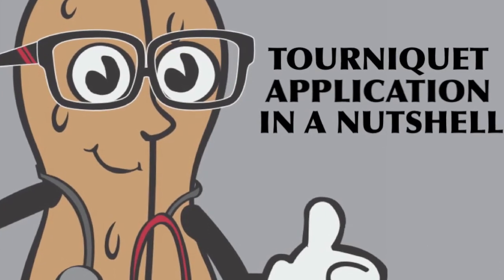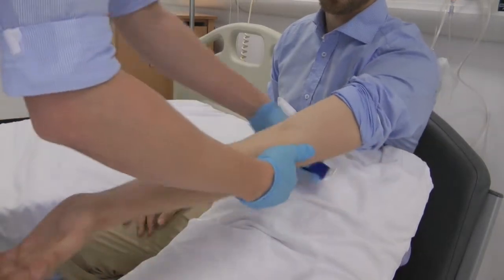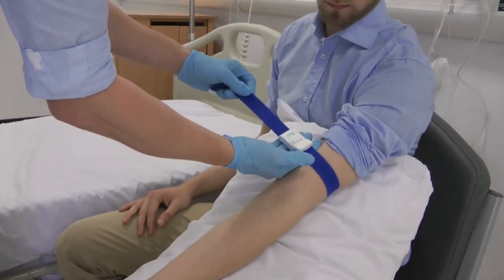Welcome to Medicine in a Nutshell's guide to applying a tourniquet and selection of the best vein. There are many different tourniquets. The qualities you are looking for are easy to apply, easy to remove, and either single use or cleanable.